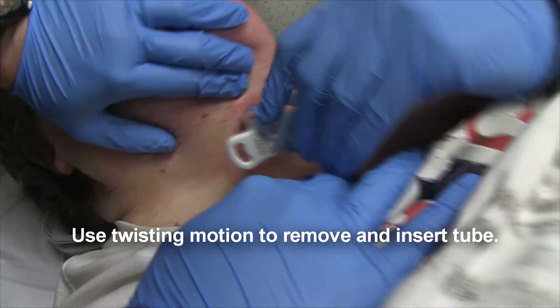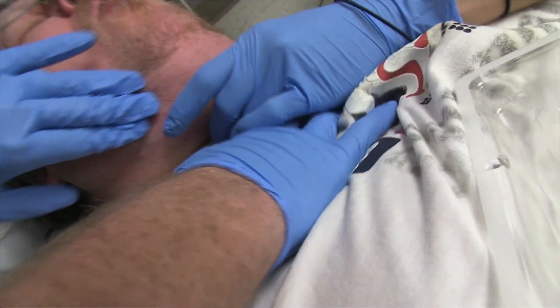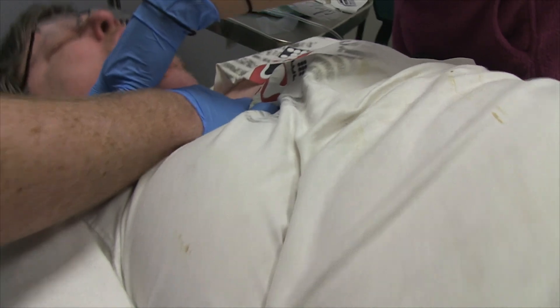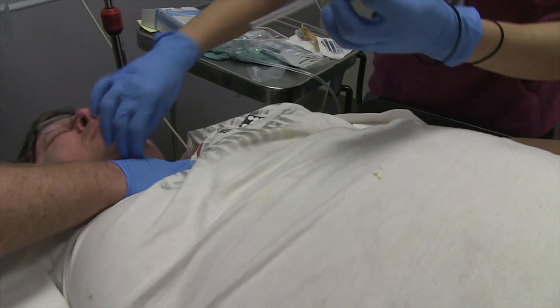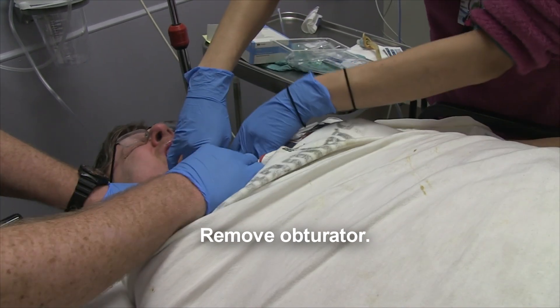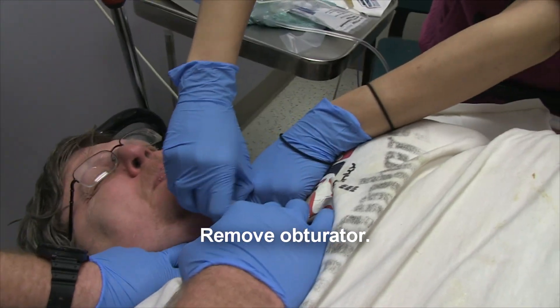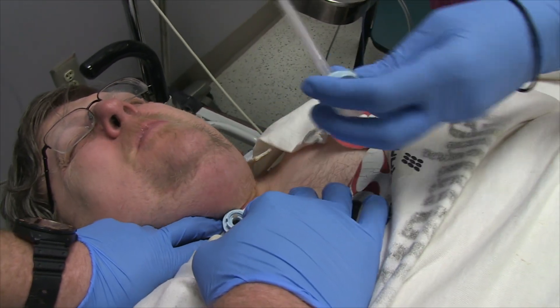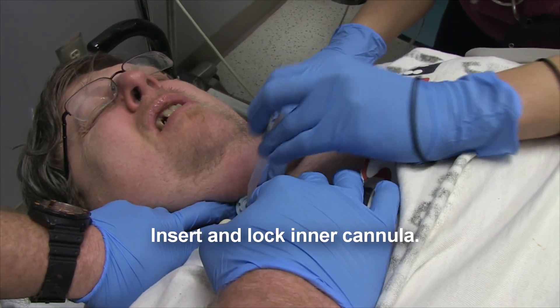We're going to the side. And then the inner cannula goes right in.